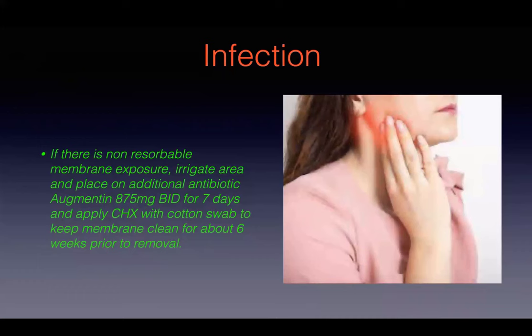The screws, these were actually tacks. I didn't use the screws for these cases. And no, they're actually 5 millimeters. They carry them in three. The three, I feel like it just doesn't do a good enough job to really grab hold of the bone. They don't stay in, they come out. So I do use the 5 millimeter one.